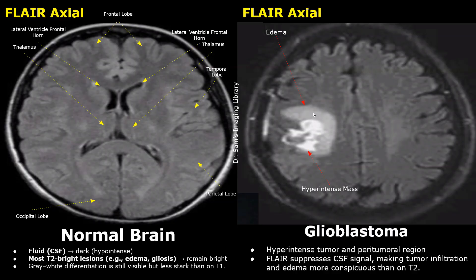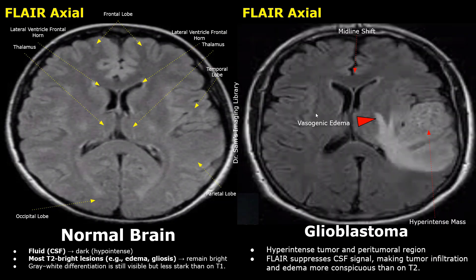Here is another case of a glioblastoma. In this FLAIR image, the mass is hyper-intense and vasogenic edema is also hyper-intense but has a smoother, homogeneous appearance.